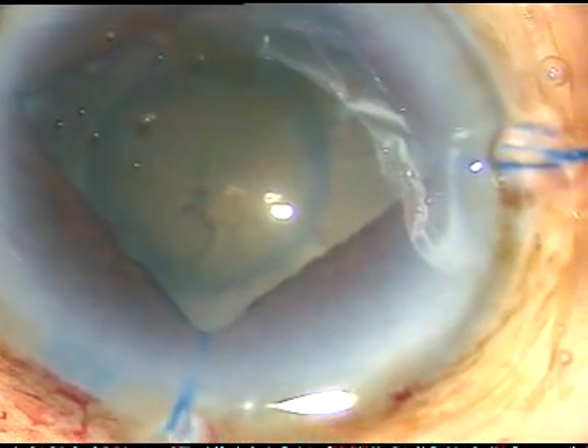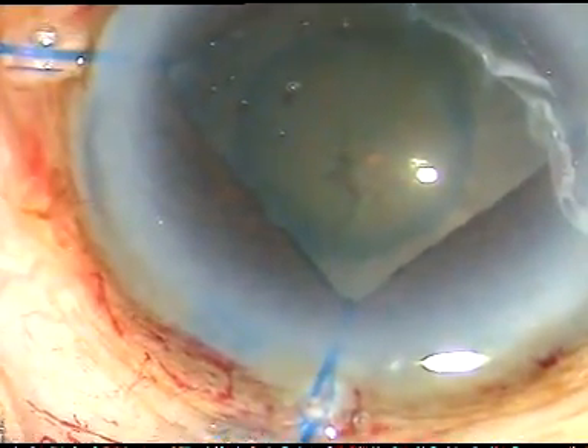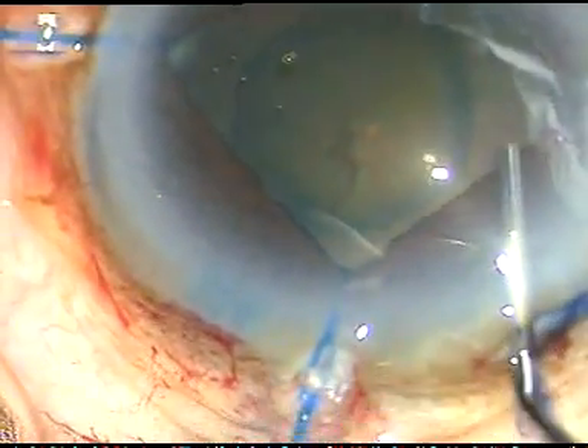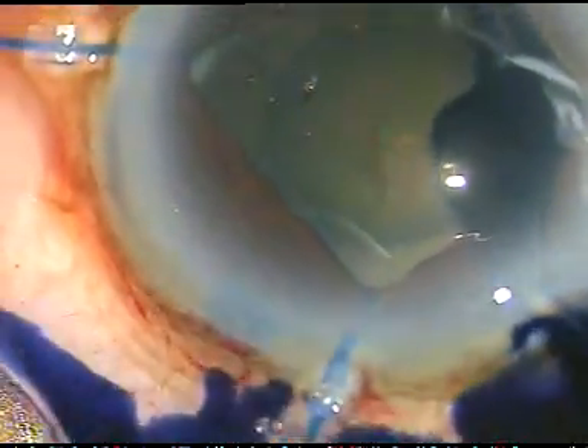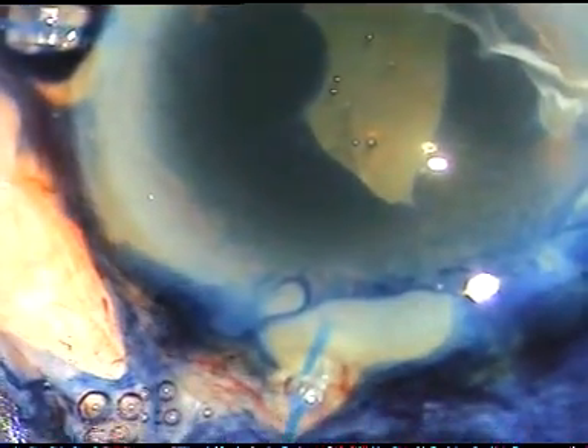I have to apply a CTR, and for that I need some more staining of the anterior capsule. I am painting the capsule underneath this viscoelastic substance, just over the anterior capsule I apply the dye. It is possible to stain the anterior capsule very well — just paint the capsule underneath the viscoelastic substance. Now I wash the dye out and I have got adequate staining of the anterior capsule.